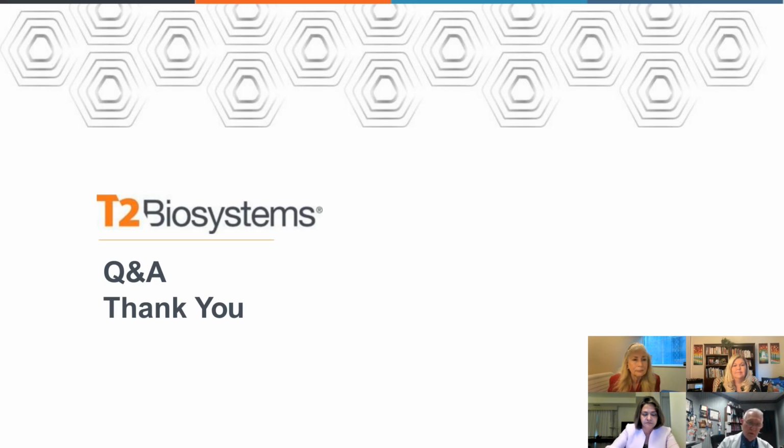Well, we have it in the molecular laboratory, and the staff there around the clock. Initially we had to find out how many people do we need to cover the 24/7. Once we did that, the workflow has not really been a problem because they know that when it comes in, it's a stat test and they process it immediately. And so overall, it's not been a problem.